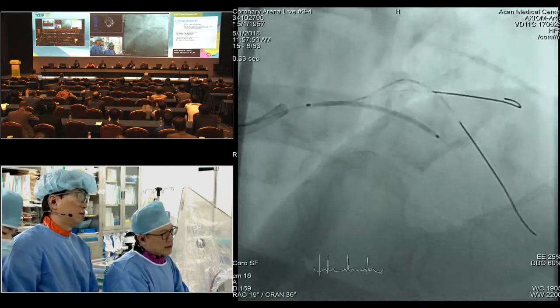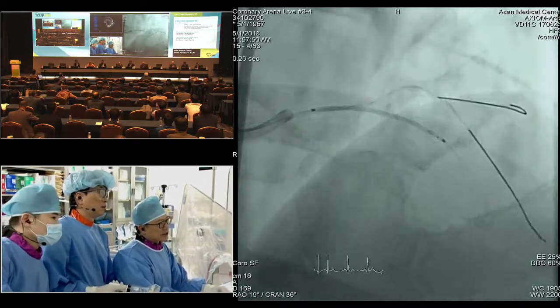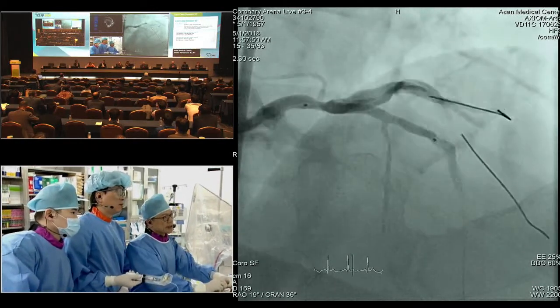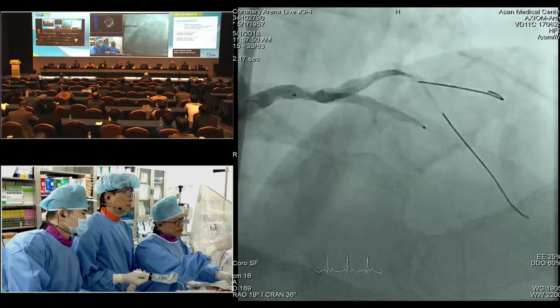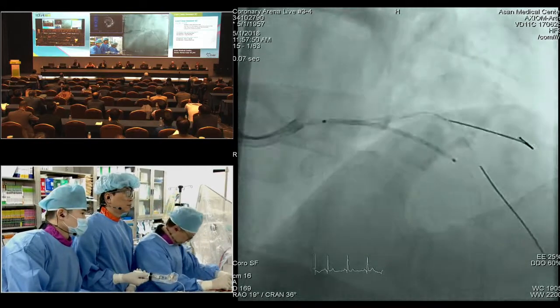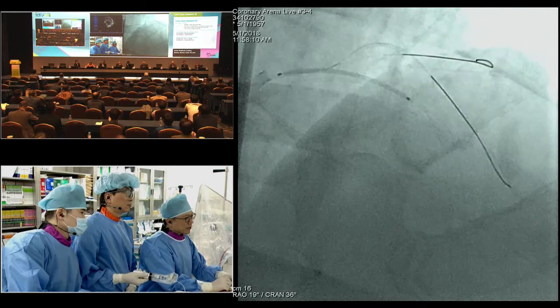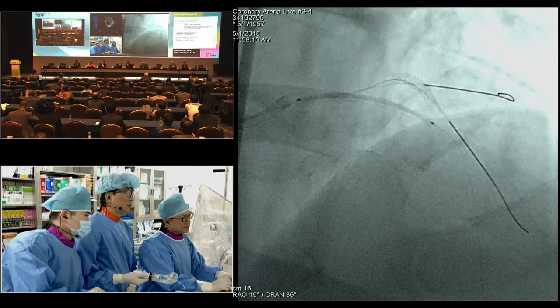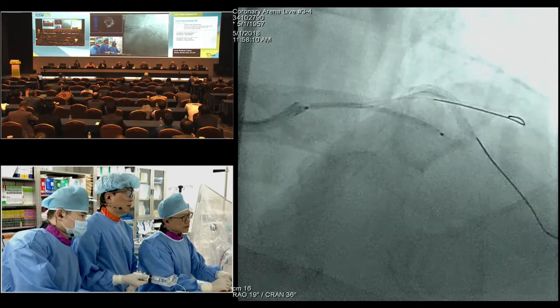So this is, just to have an idea how long this thing is. I think we can certainly come back a bit and cover a bit more left main, and then end up in the area that we were thinking about, just that little bit more of a disease, still disease, and maybe we can have a little bit more normal area there. Maybe test it. Test, please. A little bit. Pull back a bit. I think that's good. Okay.